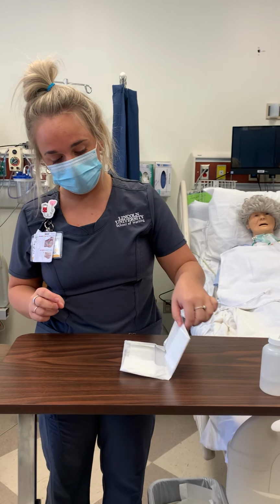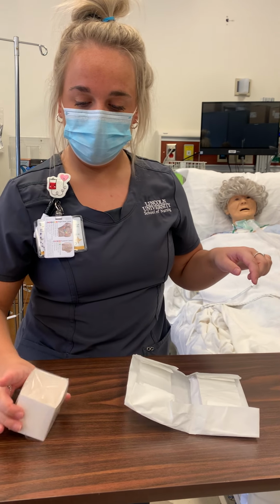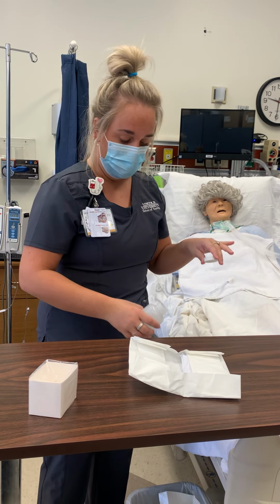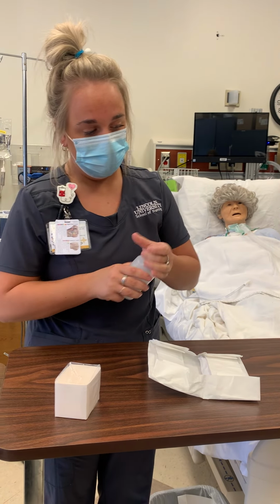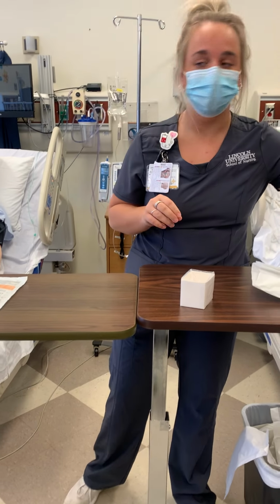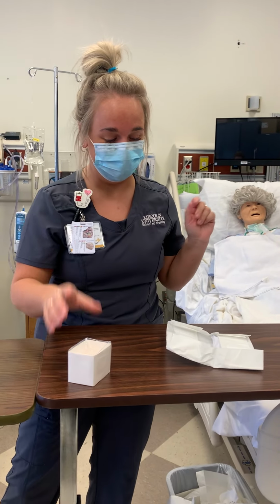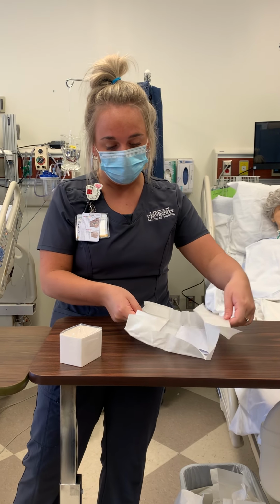Okay. I'm just going to take out this little basin part. And since this normal saline has already been used, I would rotate it and get that top film off of it. Then I would go ahead and dump it in. Okay, now I need to put on my sterile gloves before I do anything else. So I would do hand hygiene again. Oh. Before I put on my sterile gloves, I'm gonna actually go ahead and open the kit so I don't break sterility after I have my gloves on.